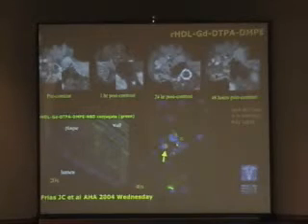Let me see what I have. Okay, I guess, because PK is here, and we're very excited about our work with the HDL-like particle. This is using a natural lipoprotein to carry the gadolinium and to target it specifically to the vessel wall itself. I know Sam Semikas is also in the audience. He's been doing also work with nuclear imaging and molecular imaging. So this is the MRI approach. And what's interesting about this, and this is now using the HDL-like particle, is that it behaves like HDL itself.